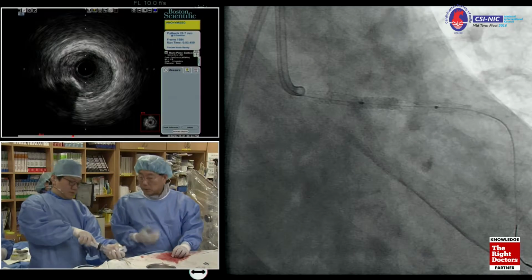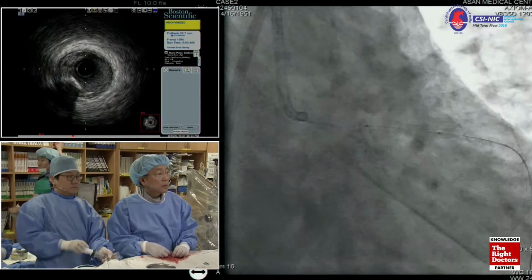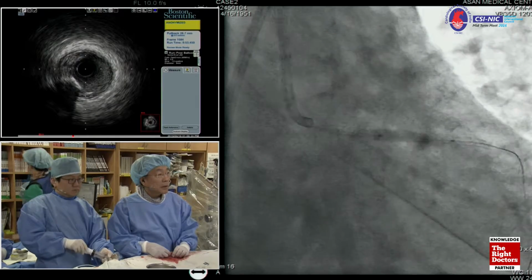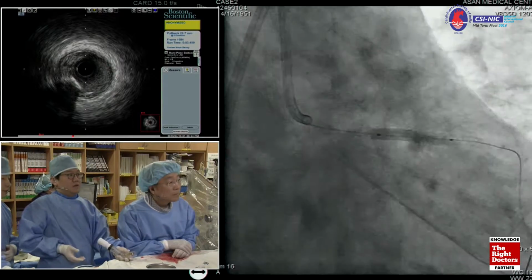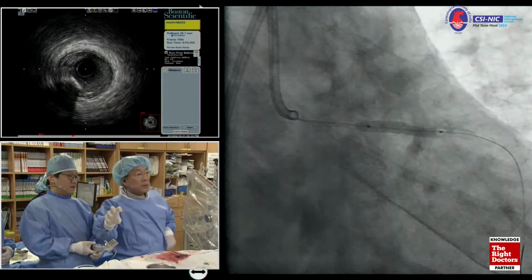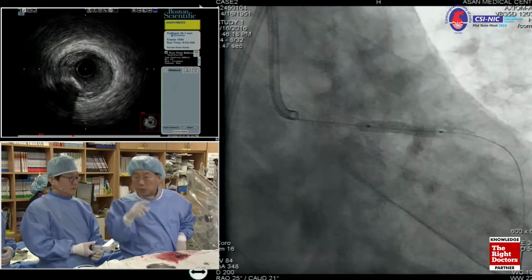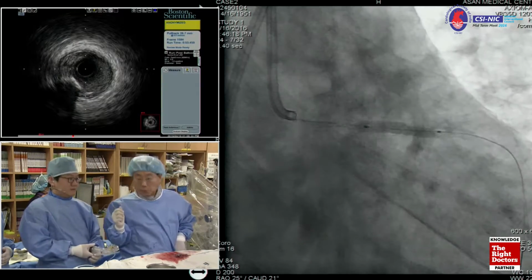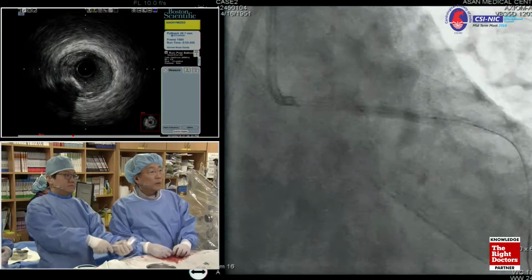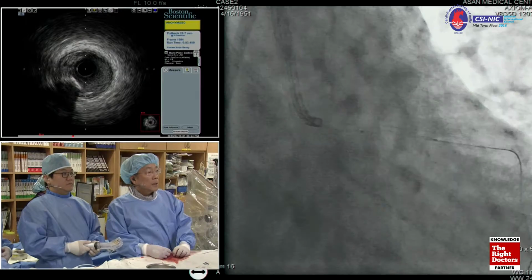Air mainly. Okay, why not? So we can clearly see it. I want to see that. What's happening? Okay, good, perfect. Some tapering, yeah, but this balloon. The stent diameter is balloon. The reference vessel diameter is not too big. It's up to 3.5. Okay, deflate. And proximal LAD and left main.